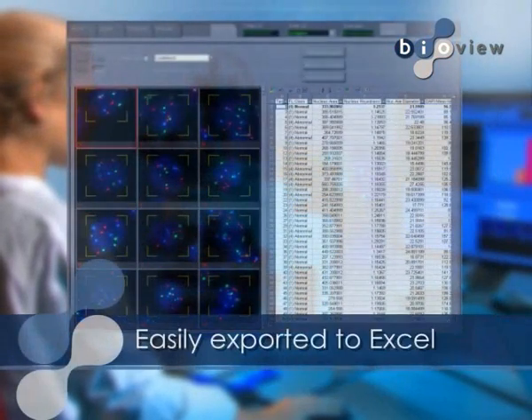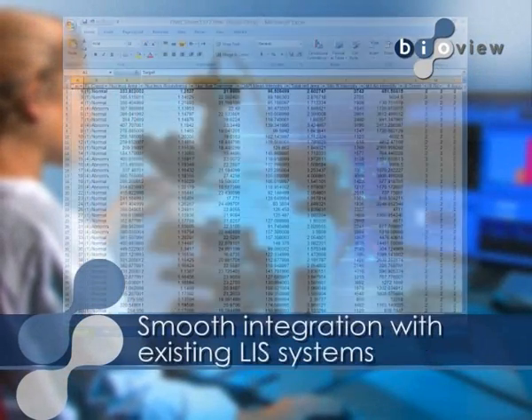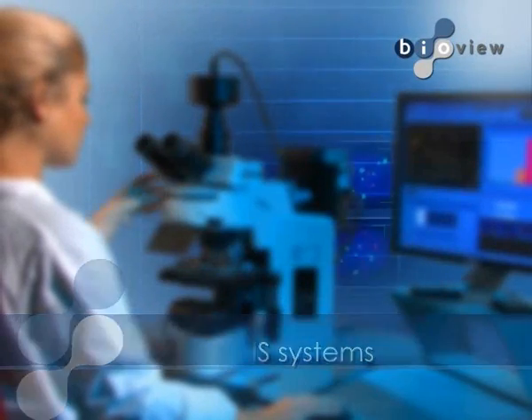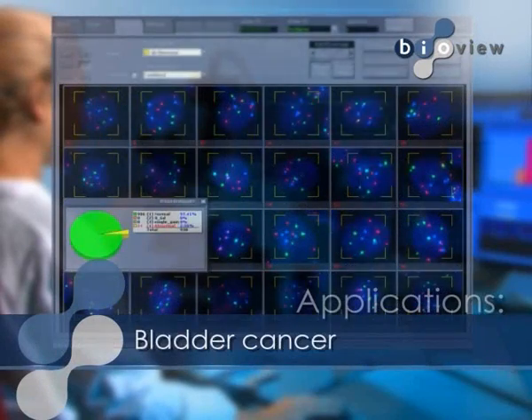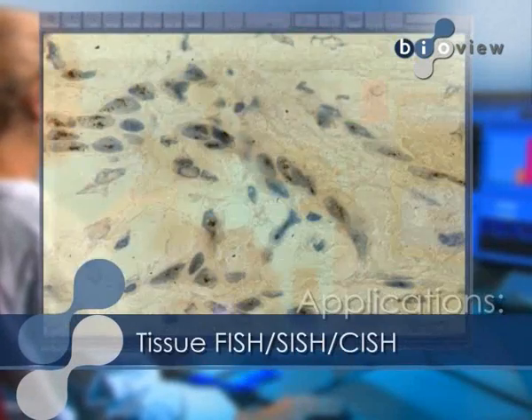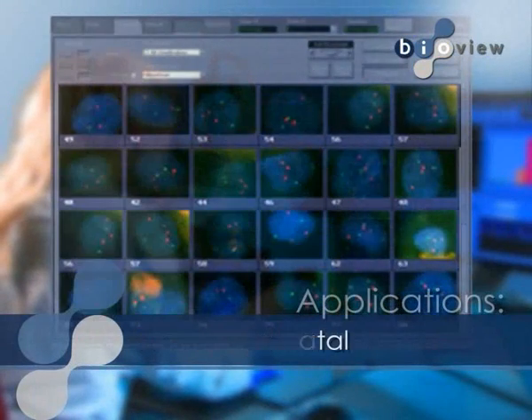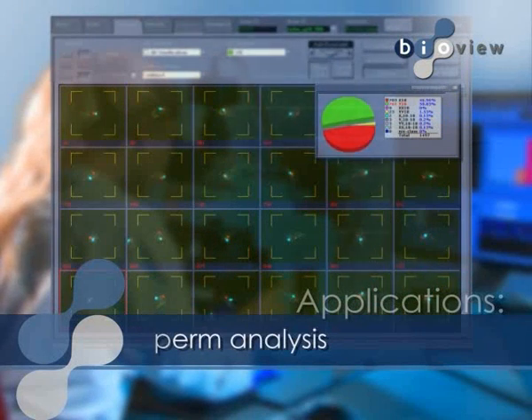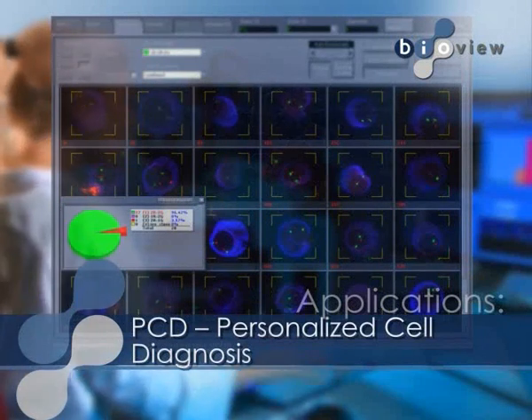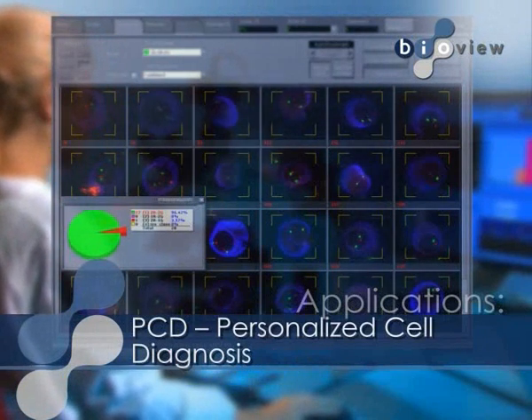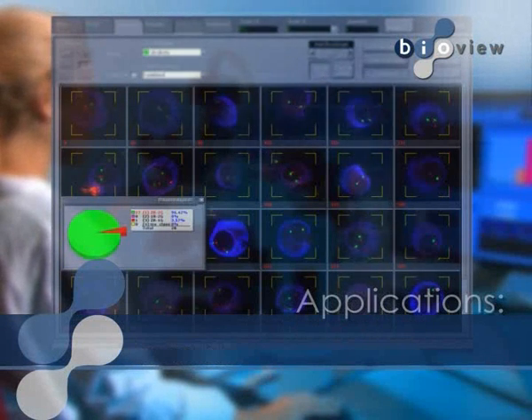Analyzed data is easily exported to an Excel spreadsheet for smooth integration with existing LIS systems and research data sheets. Legato can accommodate a large number of FISH applications ranging from oncology, to pre- and post-natal sampling, and sperm analysis. In addition, BioView's PCD application provides tailored imaging, detection, reporting, and analysis solutions for cell suspension and tissue-based samples hybridized with fluorescent markers.